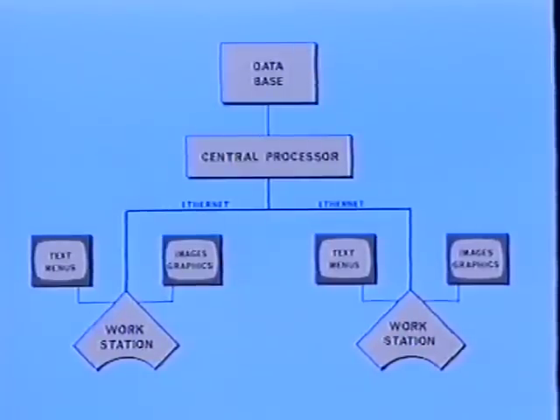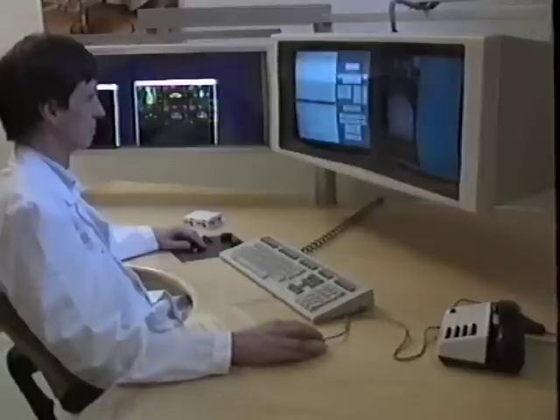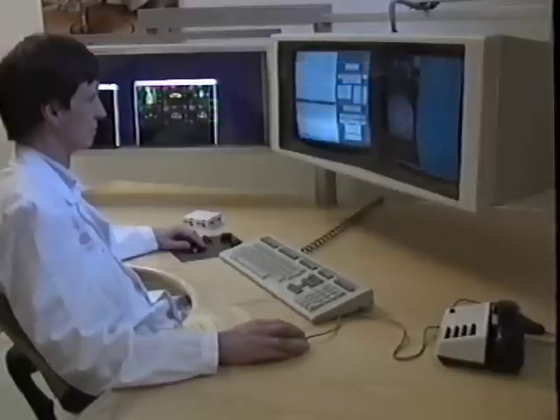The modern computer architecture used in TMS, through VAX computers connected to Koala image processors, is a local area VAX cluster. The central database in TMS uses the Relational Image Database Manager MIMER, which makes storage and retrieval of all relevant patient data fast, flexible, and safe.